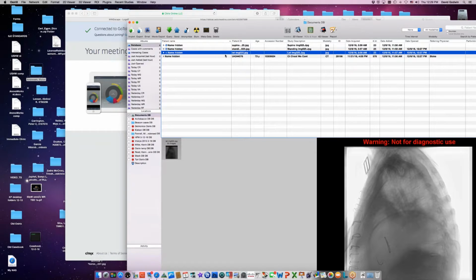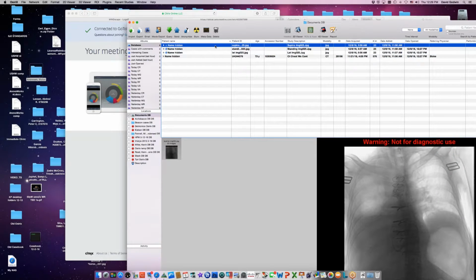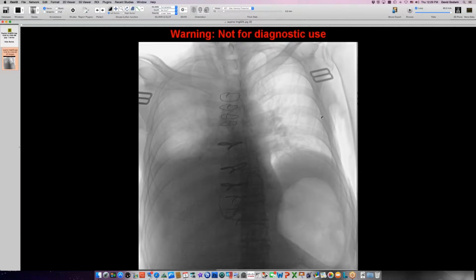If this person had difficulties in cooperating with the fluoroscopy, we could have used that information to suggest that this diaphragm, despite its elevation almost front to back, was not paralyzed but was eventrated. And we put him supine, which adds to the stress test of diaphragm fluoro. It loads the diaphragm and it prevents people from getting that false orthograde motion that is just from relaxing abdominal muscles, maintaining themselves in expiration using their abdominal muscles, and then when you ask them to take a deep breath, they relax their abdominal muscles and the diaphragm passively falls, but it looks like a nice inspiration.